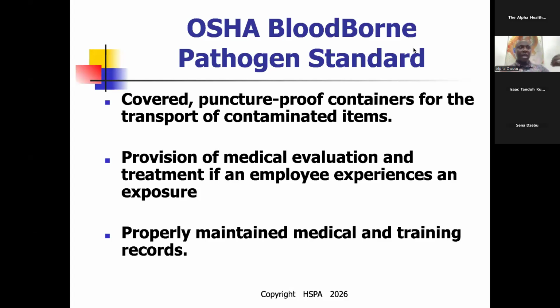scopes, we have to align the serial number of the scope to the patient's medical record number, MRN, right? So that we will know that scope number 3789 was used on patient MRN 567. It was used on this date. And then we come back, we reprocess it, and then we use it on another patient. And so if there is an infection, we can do bilateral tracing from the sterile processing standpoint and the end of use standpoint. Please, our medical team, if we are not doing this, we have to look at this. It's very, very important.